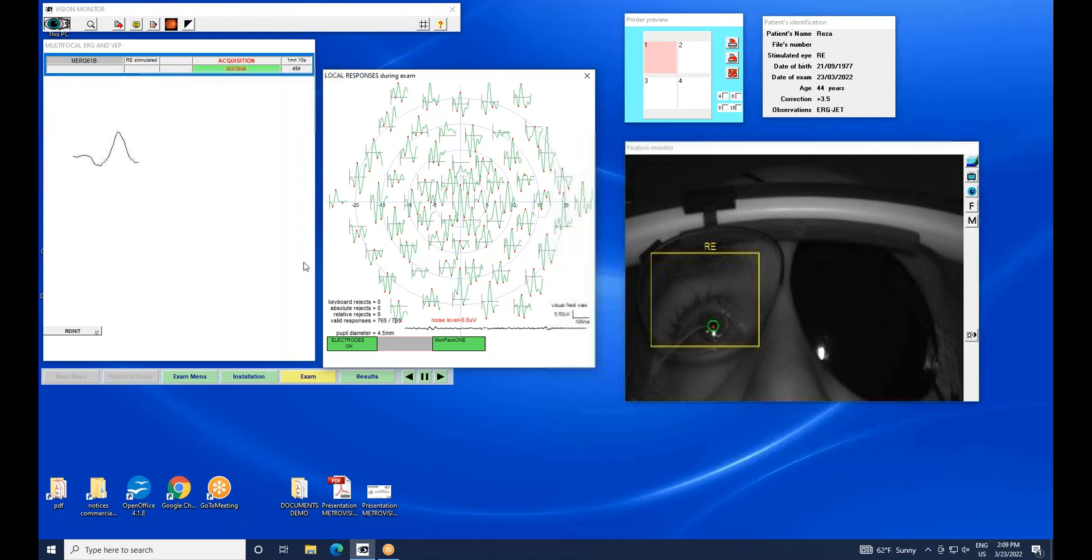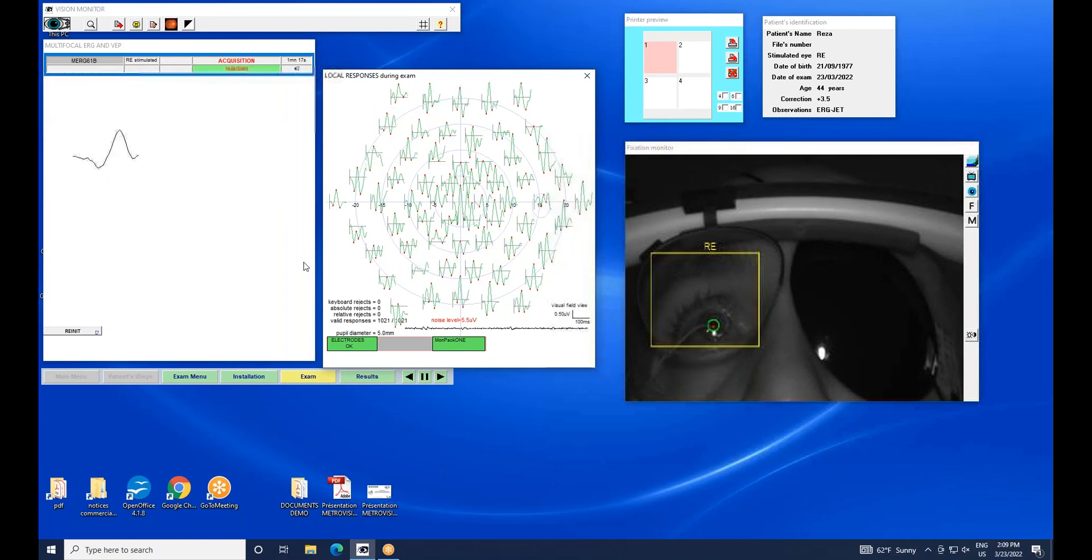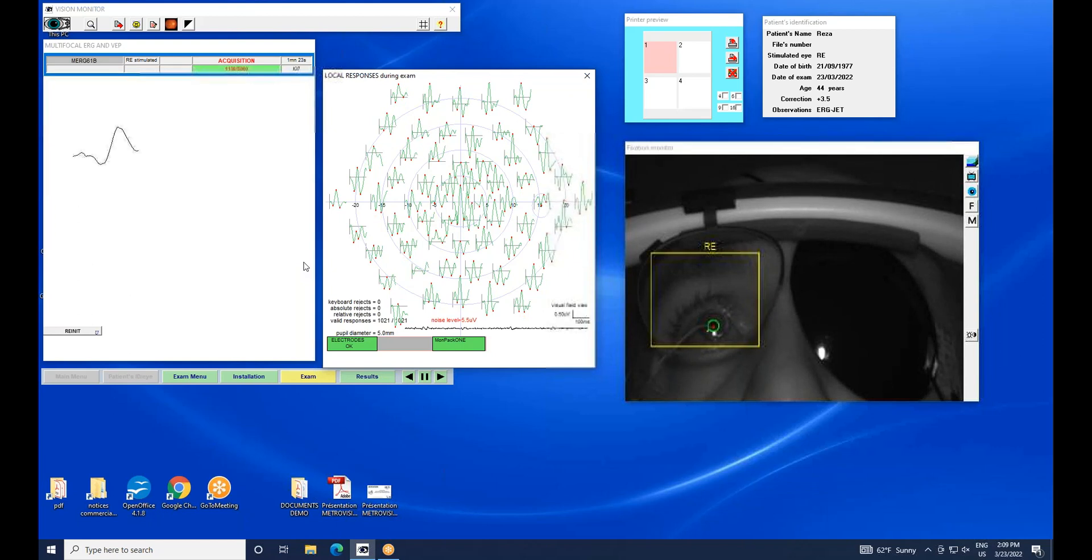After about one minute of recording, there is a sufficient number of responses for the software to automatically calculate the local responses. This is what is displayed now, with an indication below the traces of the noise level.